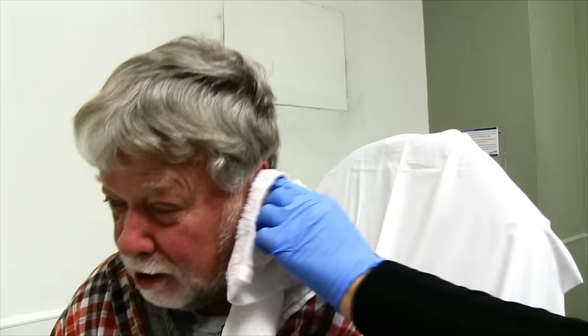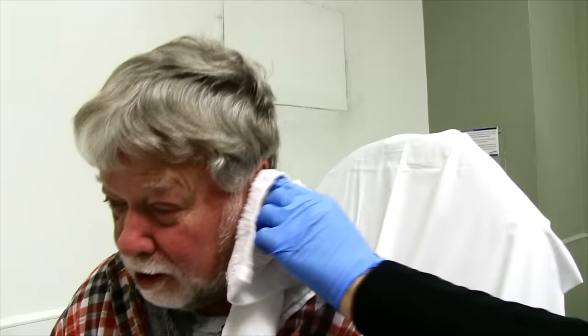Go ahead and shake your ear out — just let it drain a little bit. Oh yeah, I can hear better. You feel like you can hear better? I can hear in stereo now!